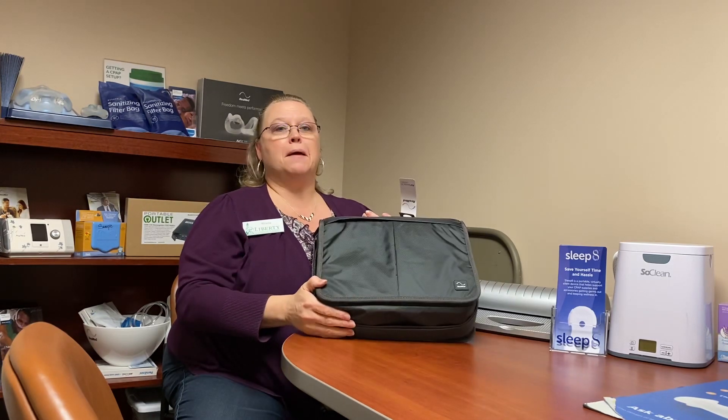Hi, this is Elena with Liberty Oxygen and Medical Equipment. I'm here today to show you how to set up your CPAP machine when you're doing a curbside pickup.